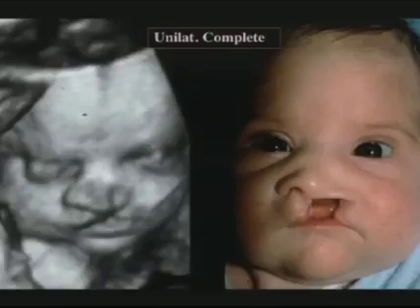So let's look at some clefts. Now in this case, we're looking at a cleft lip and palate. And those are easy to identify both in 2D and in 3D. But the 3D is helpful for the parents to appreciate what the child is going to look like, and also for the plastic surgeon who is not particularly trained in looking at cross-sectional imaging and ultrasound. So here you can see how similar the cleft is looking to the newborn, because there's a large hole right here and some collapse of one side of the nose.